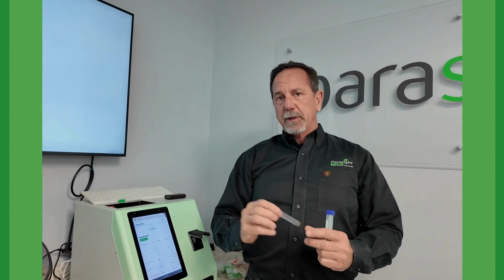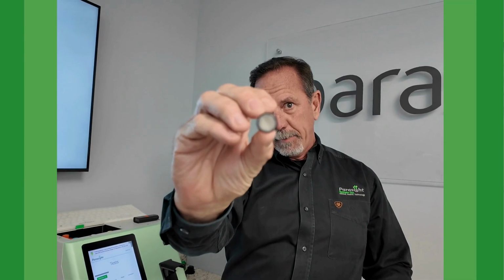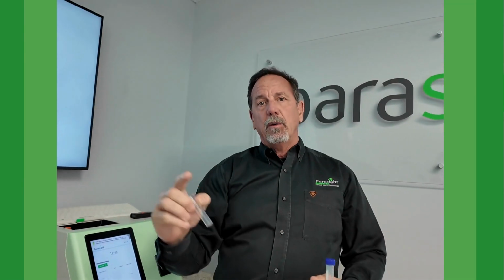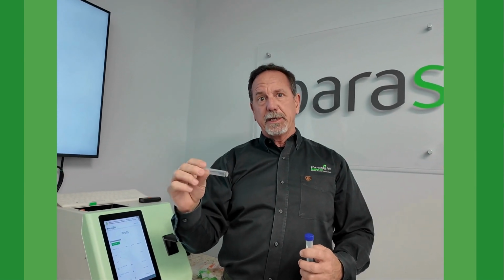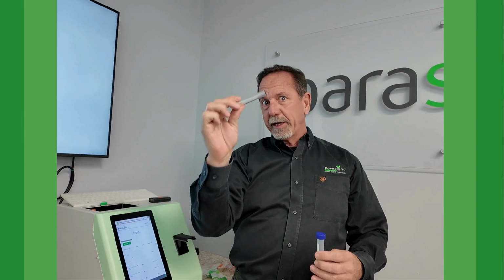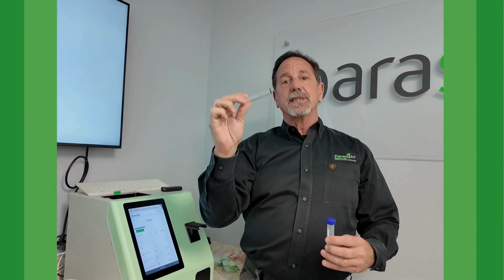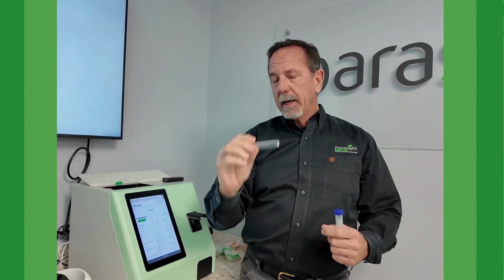The way that egg separator works is it helps clean up your specimen so that we have very clear pictures. You can see here there's a fine mesh at the bottom of that, and so we can tell when we look at your pictures, if you have a lot of debris in your pictures, that means that you're not using the egg separator, and the test will not be as accurate as it could be as if you were using this, okay?